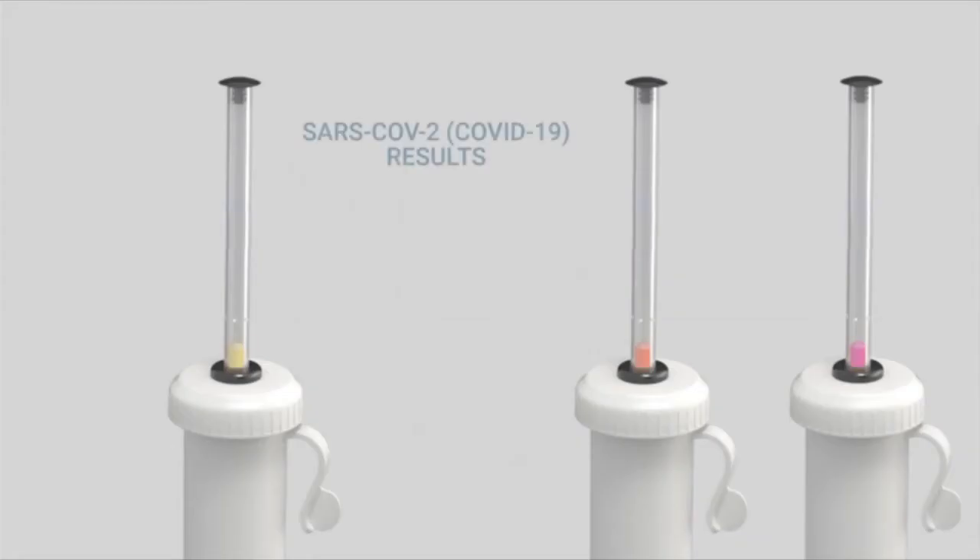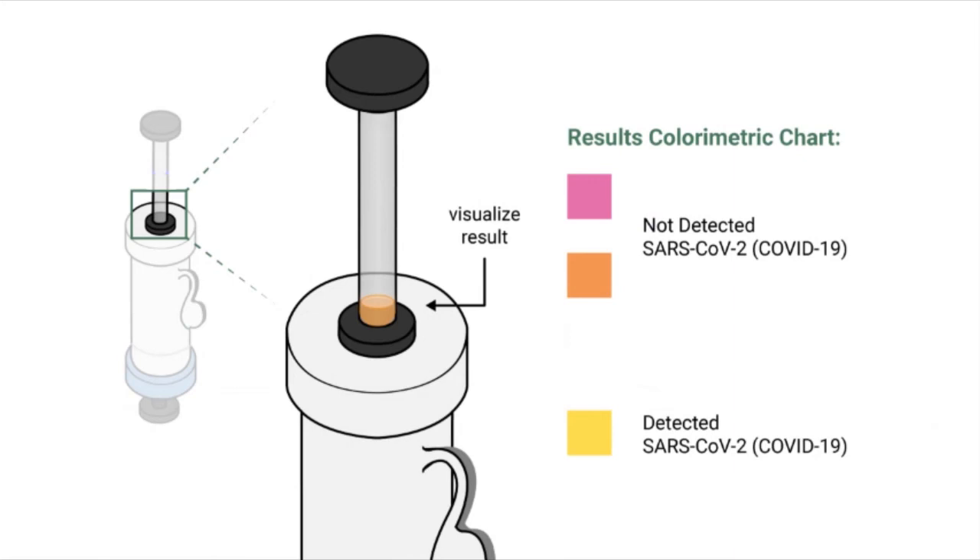If the hue is bright purple or deep orange, then the test did not detect COVID-19 in your sample. If the hue is bright yellow, then the test has detected COVID-19 in your sample. Please note that results visualized beyond 5 minutes after removing the tube from the water are considered unreliable. If there is no visible liquid in the plunger in the area above the white cap, then the test is faulty. Be sure to check the color metric chart on the instruction sheet for a reference. For more information, please refer to the FAQ page on the SNAPDx.org website.